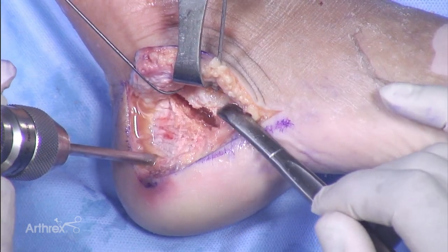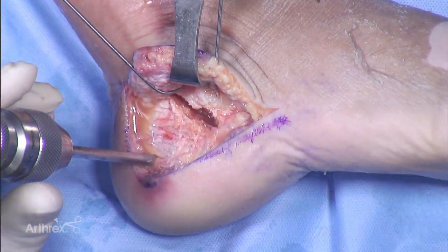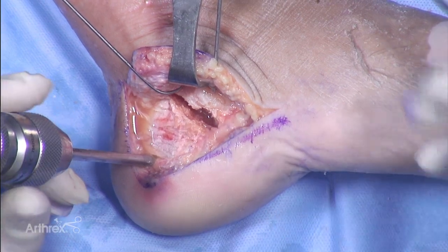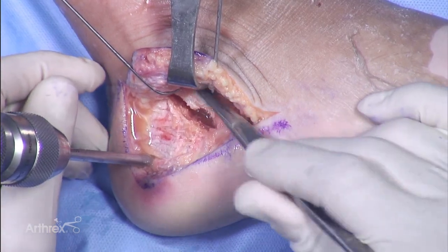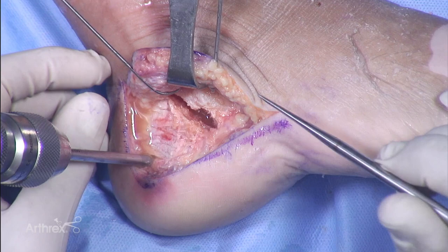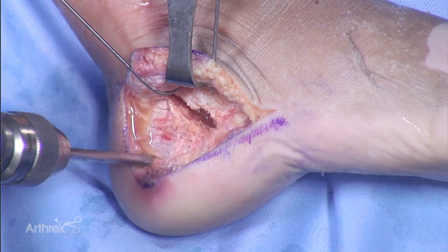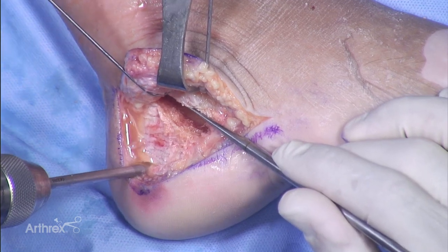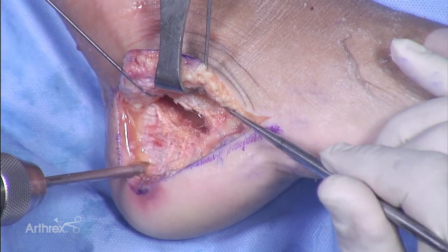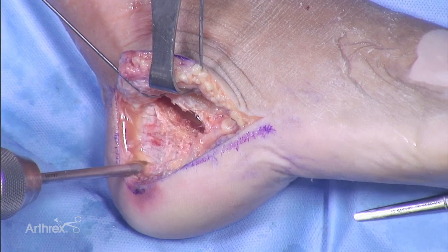If you have a deficit from cancellous bone being compressed by the injury, you can fill that gap with a cement such as QuickSet, which will give very good sub-articular support. Another trick is to use a FlexiGraft sponge that is not hydrated — it has a fairly firm consistency and you can wedge it in to hold your sub-articular support in place while you apply your definitive fixation. Once in place, you have a few minutes before it becomes hydrated and softer.